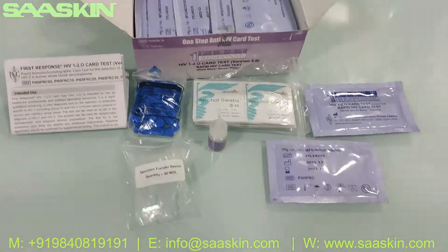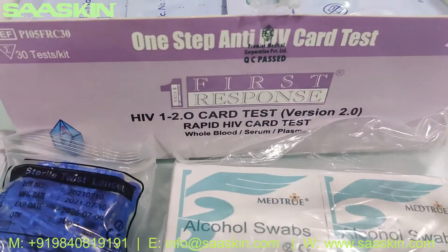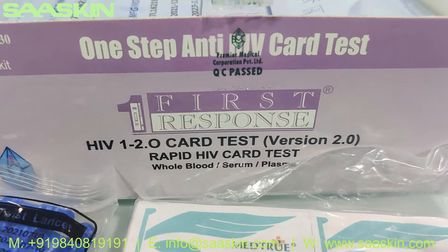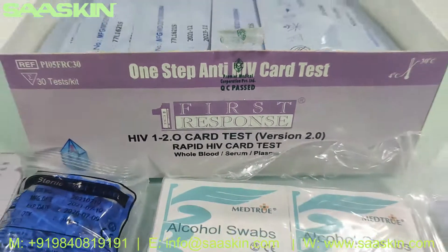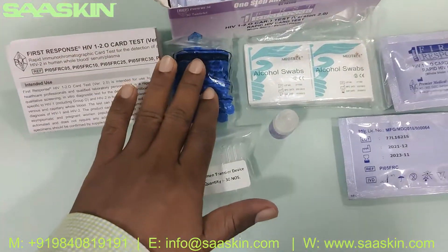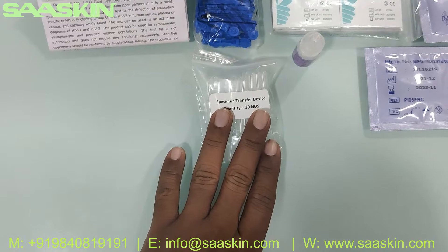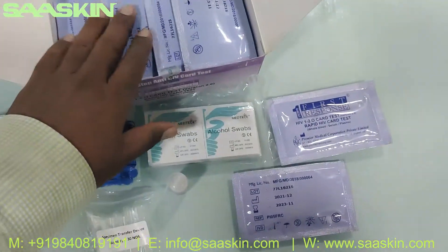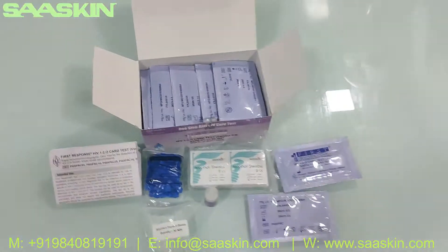Just quickly to summarize: this is the Premier First Response HIV 1 and 2 antibody card test. It contains one IFU brochure, 30 lancets, 30 specimen transfer devices, 30 alcohol swabs, one buffer bottle, and 30 test cassettes. This is how the total kit looks.